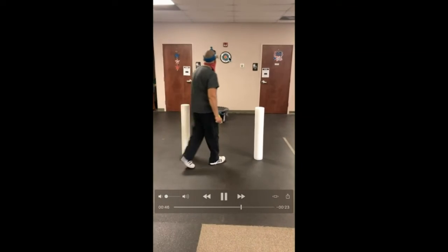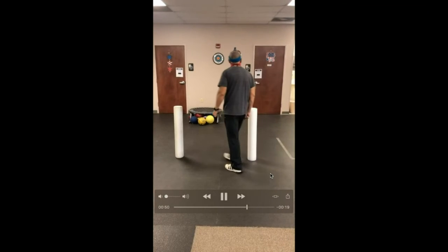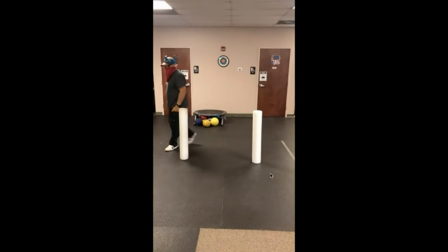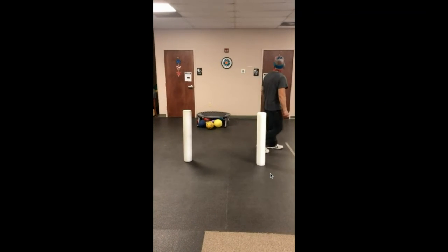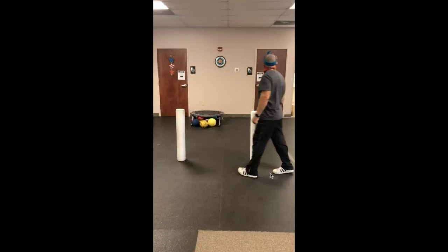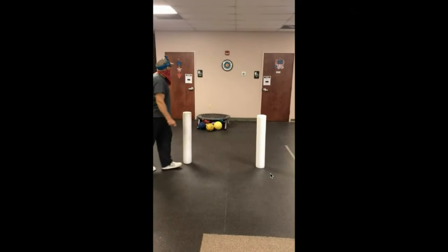Here, he's right on the target as he comes back to it. As he comes back around this way, it takes a while for him to center that back up as he's moving. So again, we have a dominant side or a hypotonic side of a symptom presentation that he has to work on. So he can see this, but he's going to need extra education about what we're doing.